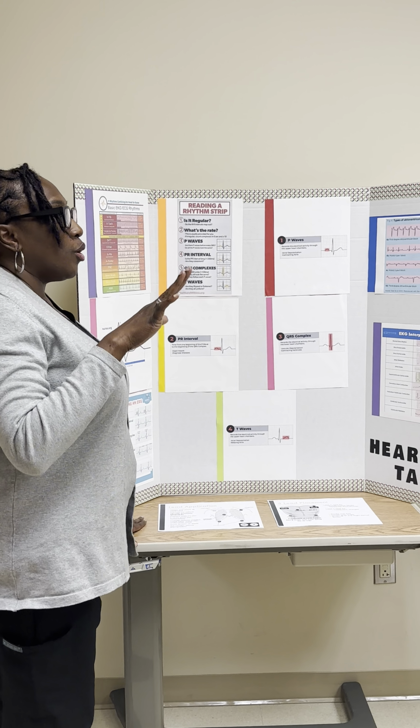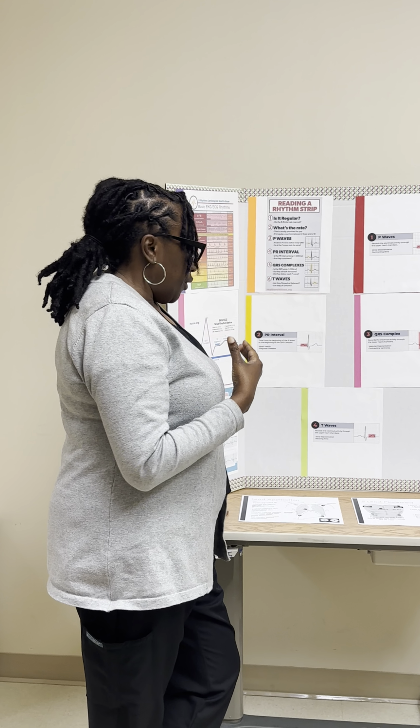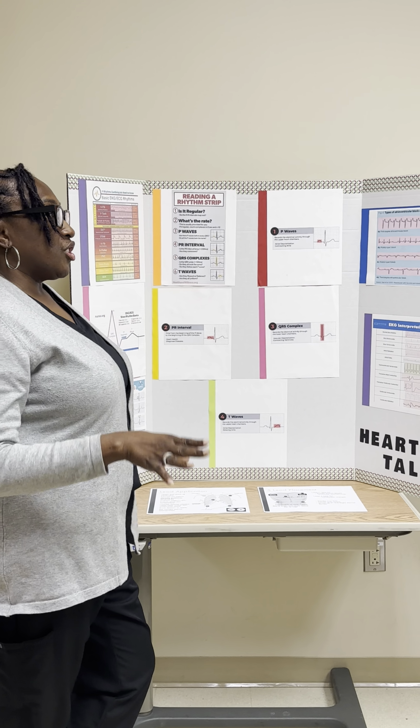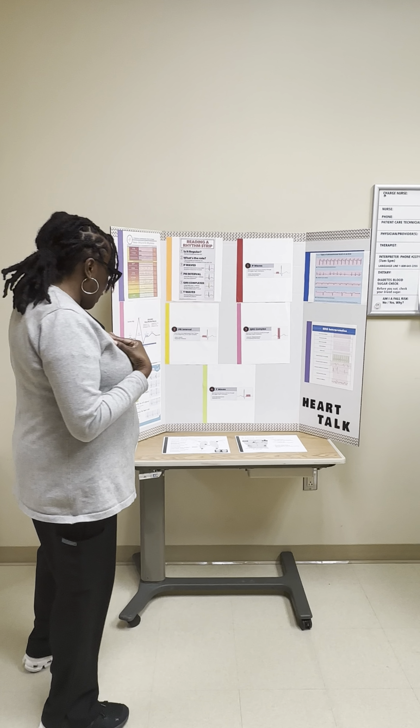Units on mobile, like they're doing remote monitoring now from Elmwood. Some people were confused about how we place these leads and how we read these strips once they come in. So it's just a basic look at cardiac rhythms. Most of us have 5 lead placement for the EKGs.